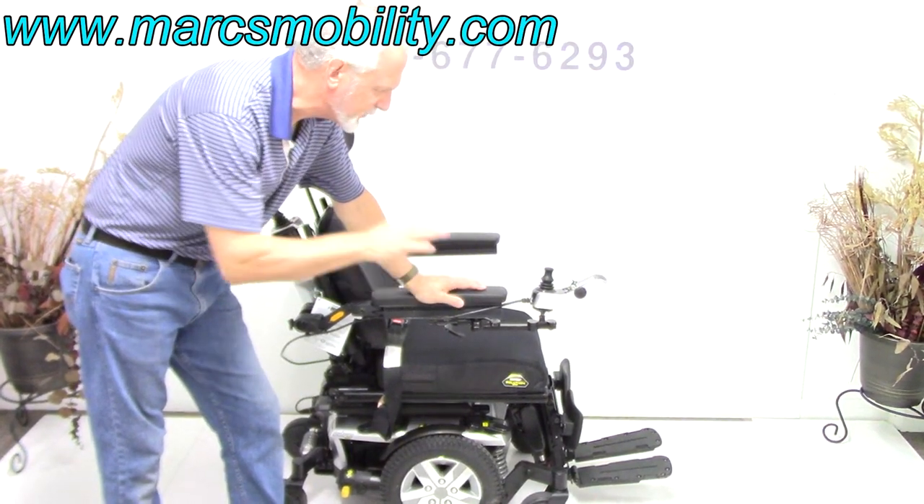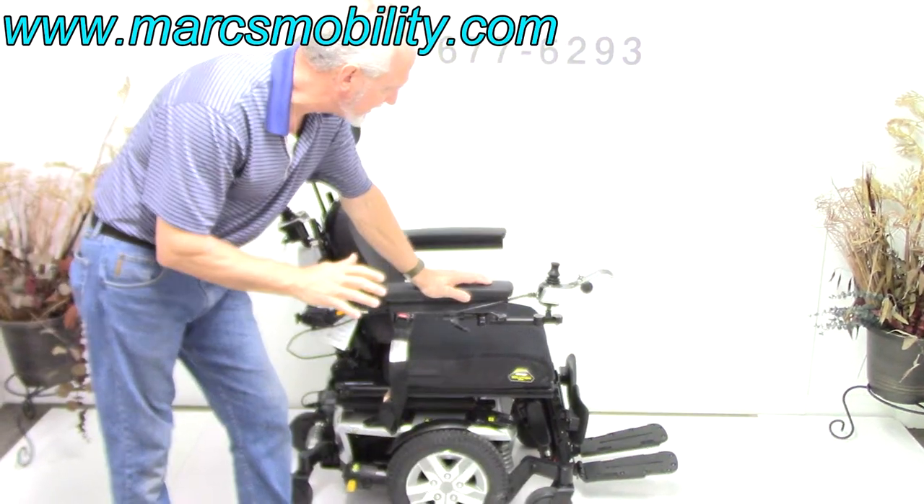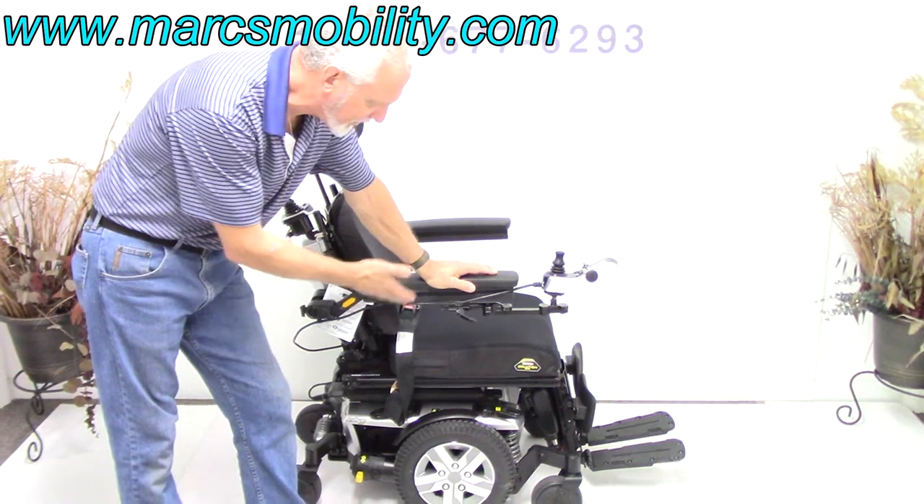It has the electric tilt, the electric recline, and the electric legs — no seat lift, but tilt, recline, and legs. New condition with very sharp looking colors.